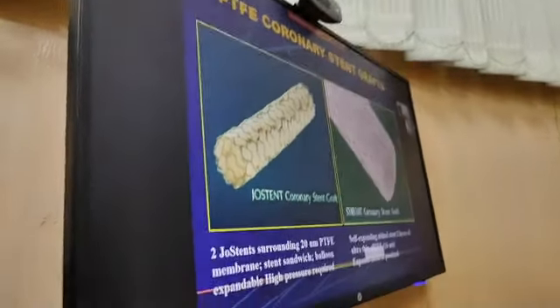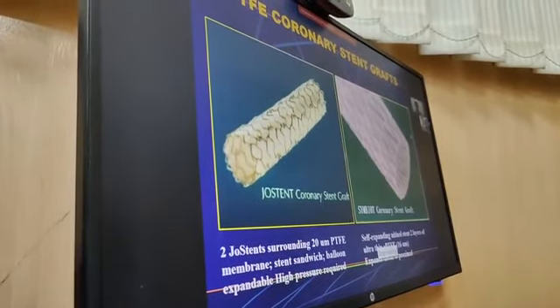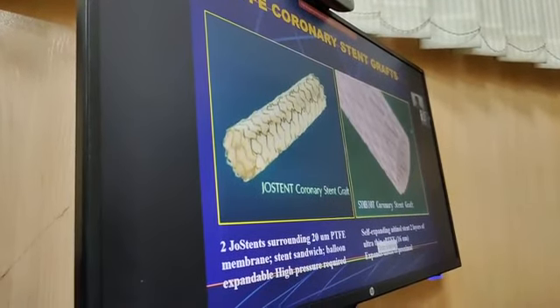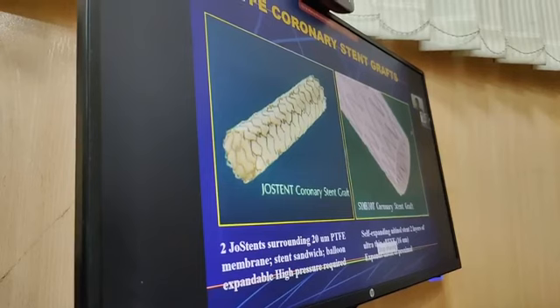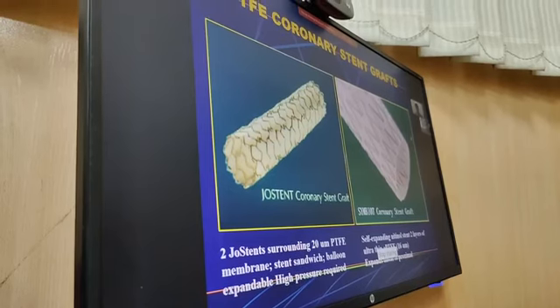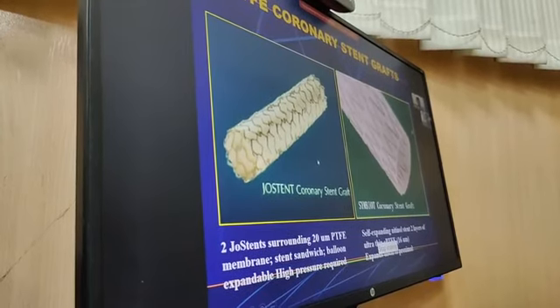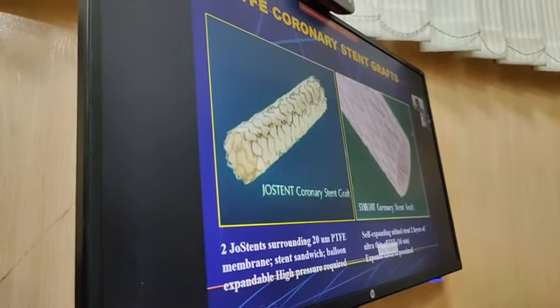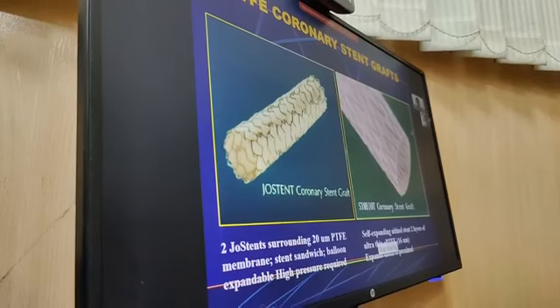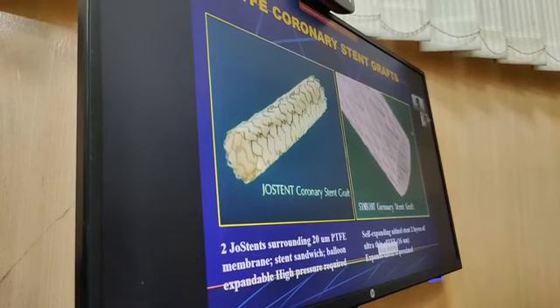because these lesions are very rugged. They not only have thrombus, they have a lot of raw plaque material, which is macrophages, cholesterol crystals and so on, which is the main problem, which causes a lot of distal embolization, and which cannot be tackled because thrombus will dissolve. That is why we cannot dissolve the cholesterol. That is why they earlier used this covered stent. They thought of using the covered stent, which was also preventing some distal embolization and further.